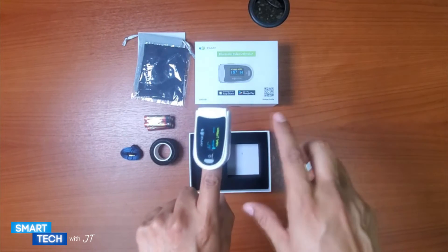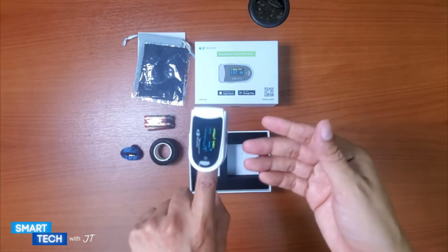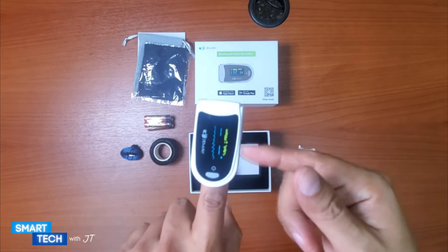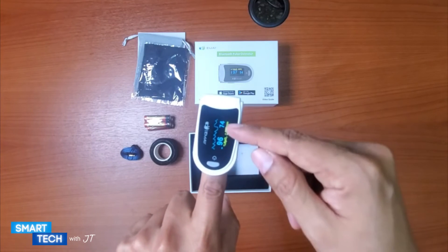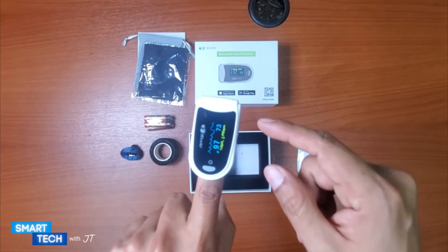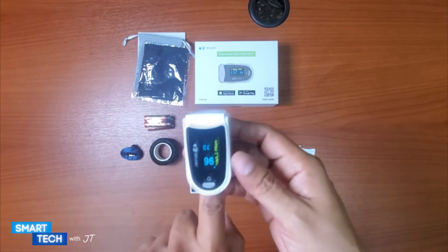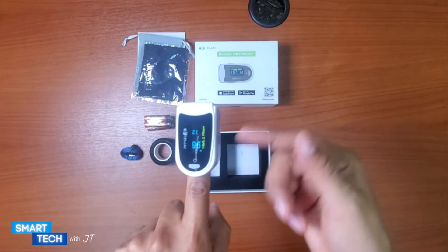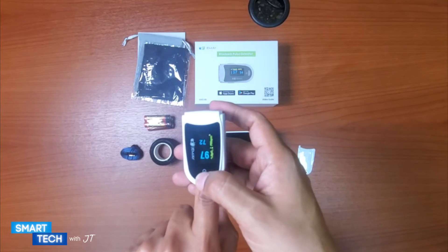You can also export the file in CSV format for further analysis or to share with your doctor. It has an accurate and reliable display, and what I like is that the display flips — it can go either vertically or horizontally, which is a nice little feature. It's compatible with Google Play and the Apple Store.